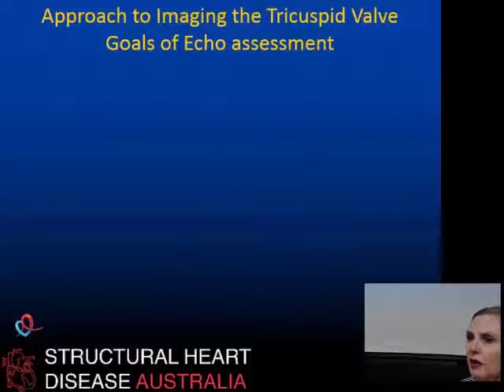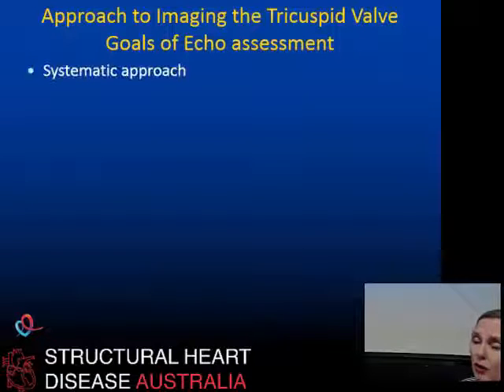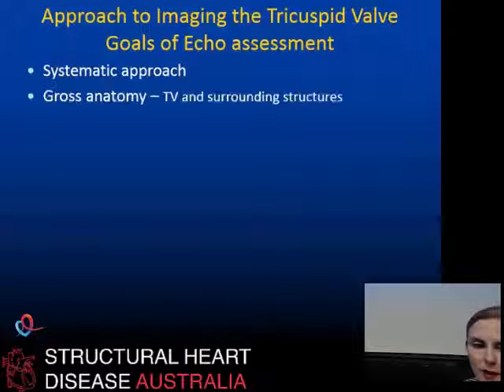We've heard a lot in this session about surgical and percutaneous interventions on the tricuspid valve, and the success of these procedures really relies quite heavily on very accurate echocardiographic evaluation of the tricuspid valve before and after these procedures. So in the next 15 minutes I'm hoping to outline a systematic approach for evaluation of the tricuspid valve.